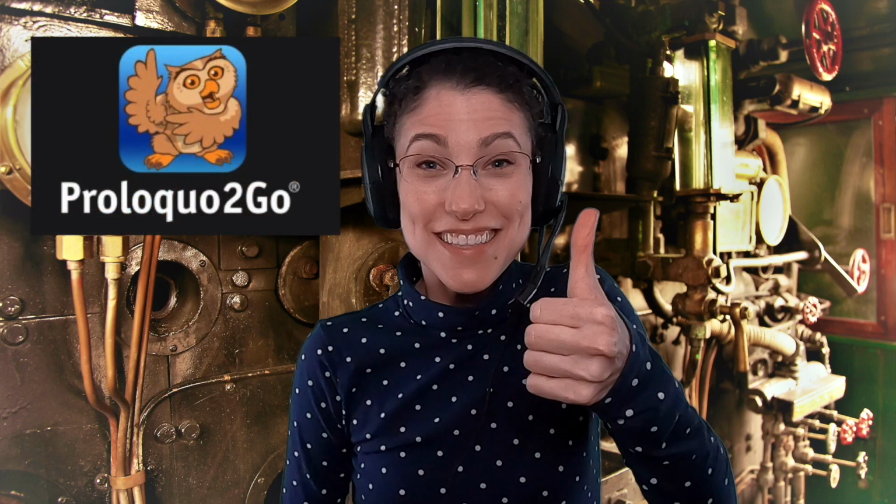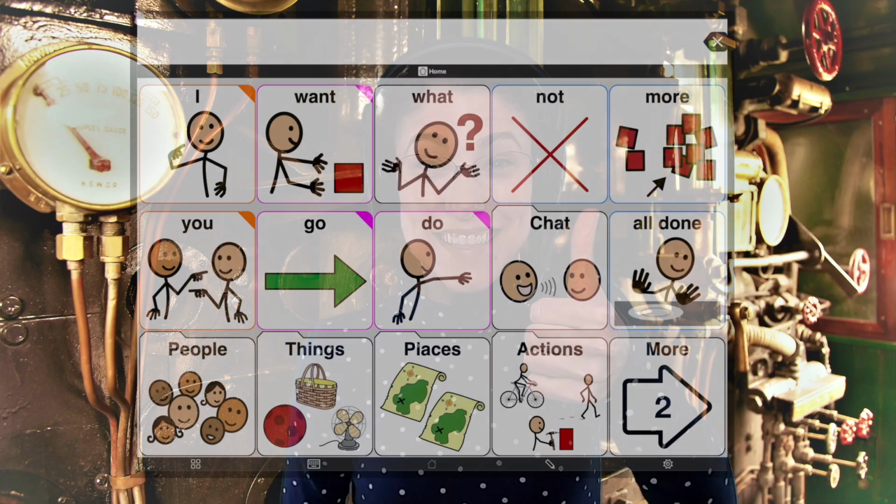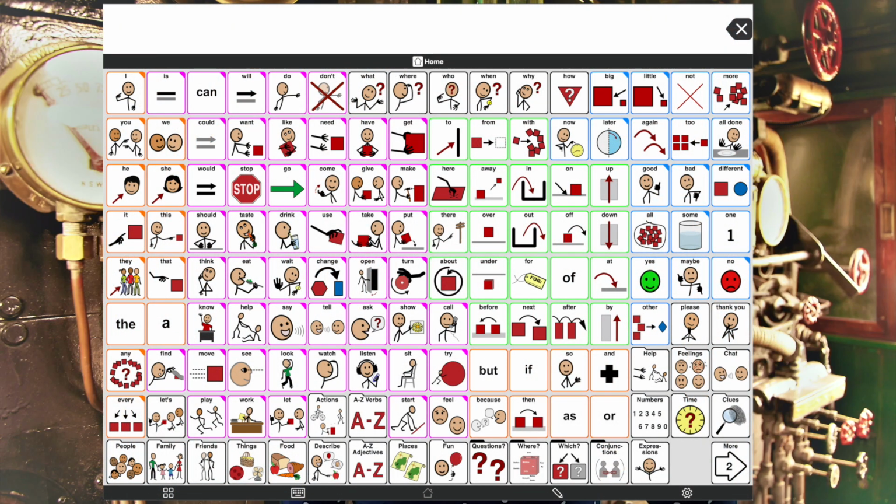an idea of how someone could use an AAC to engage with a video or book using a system called Proloquo2Go, an app for the iPad that some children use to learn to communicate. It is highly customizable for a variety of communication levels, from beginner to conversational.